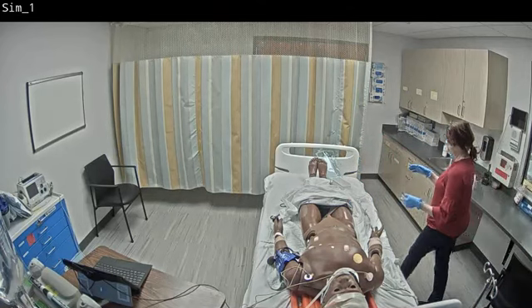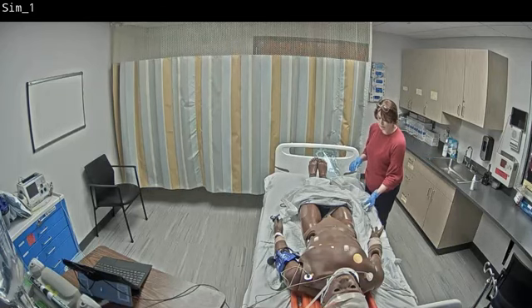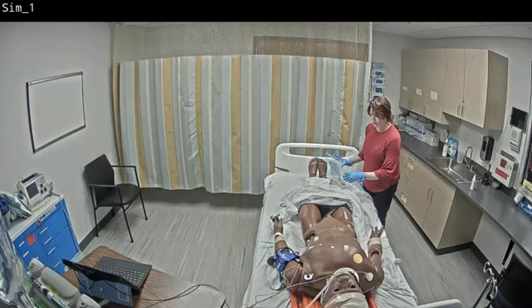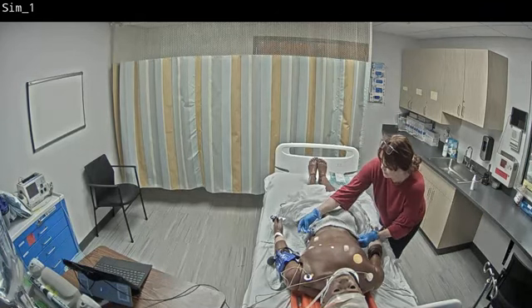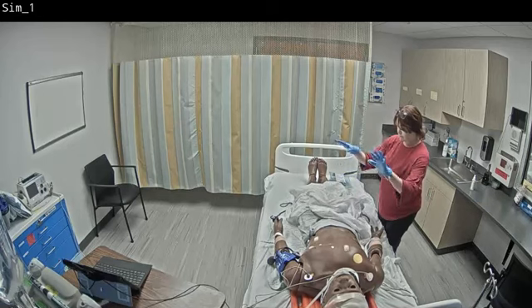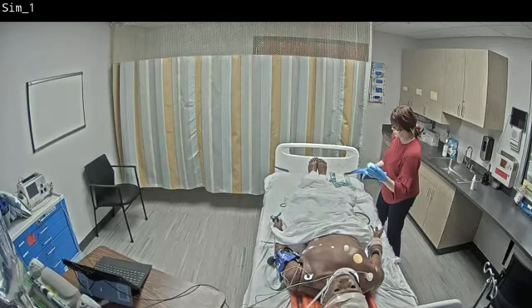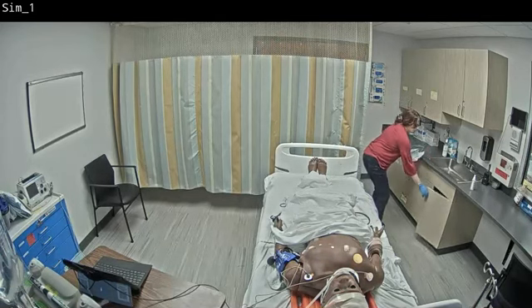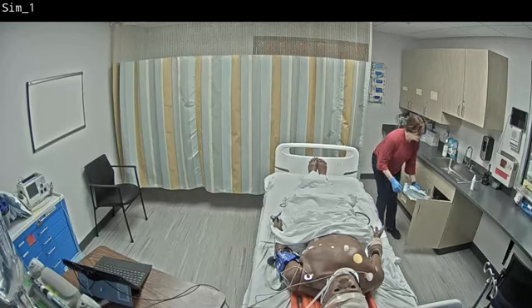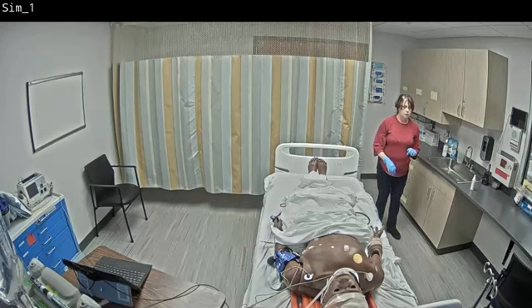And then when you're finished with the supplies, instead of throwing them into the trash, if you will just put everything back in this tray here for cleaning up, cover the simulator, put the simulator back in the position it was in with the pants or shorts back on it. Make sure you got all the supplies. And then you can open this bottom drawer under the sink on the right hand side, and there's a box in there, and just lay your used intermittent catheter, Foley catheter supplies in there.